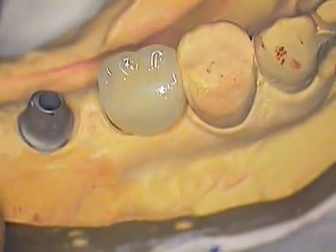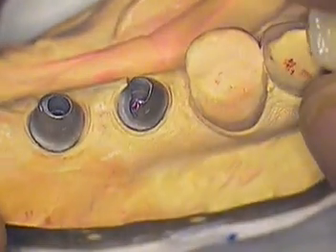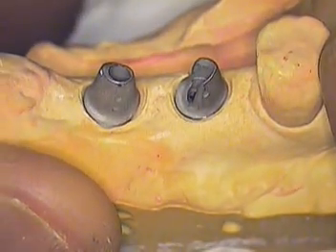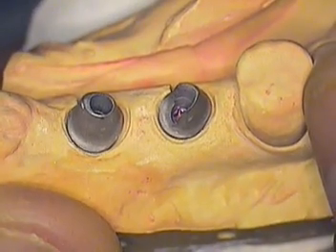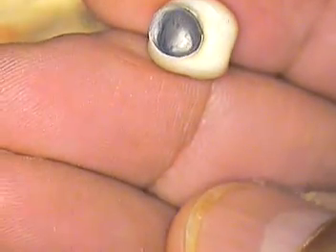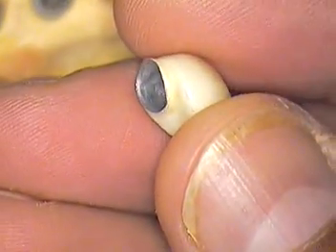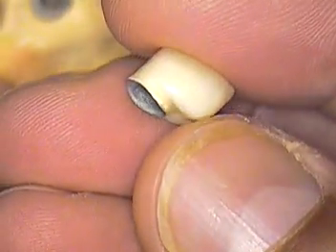The other implant is pretty much the same thing, only this one happened to be a little less — more over-contoured than under-contoured. If I look underneath, the crown itself looks as though it has an oblong look to it.